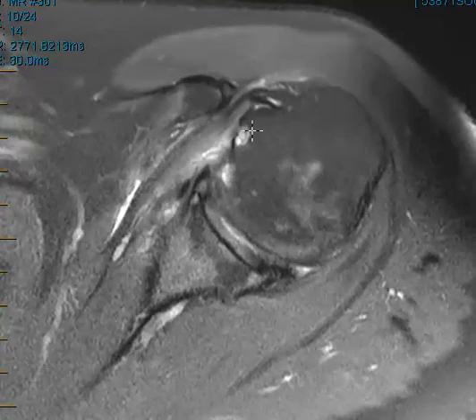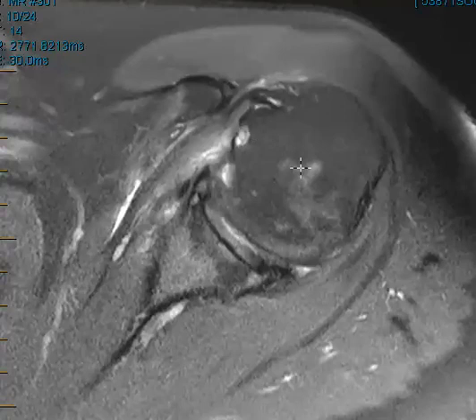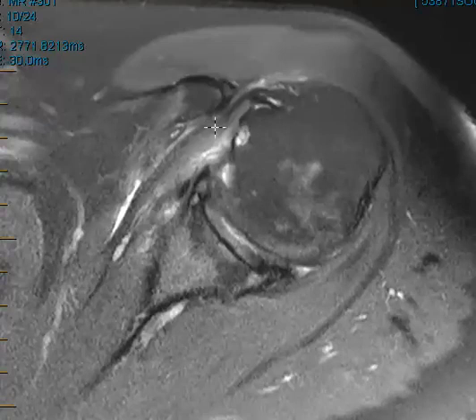Now, there's no full thickness tendon gap, no retraction, but just a severe tendinosis. We also notice that the coracoid process here is relatively close to the humerus. It can cause pinching of the subscapularis tendon between the lesser tuberosity and coracoid process.